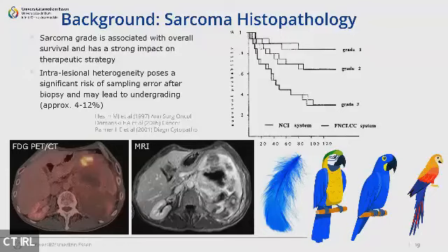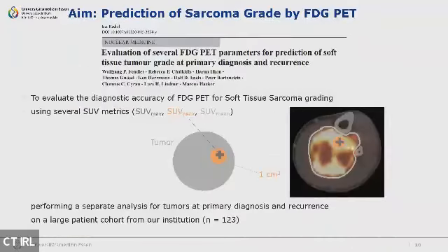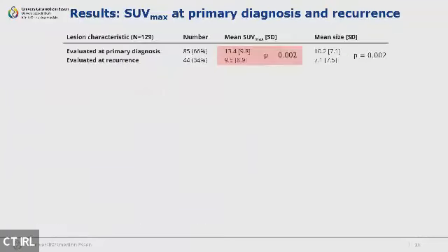You need to understand most of the bird to see which species and which branch you have in front of you. And PET-CT can help to characterize and predict the sarcoma grade by looking at the tumor metabolism. This is what we analyzed in one of these studies. By making a metabolic image of the tumor, we analyzed the uptake, the metabolism inside the whole tumor, but also the highest uptake, the highest metabolism that we can measure. We did this in 123 patients and tried to understand, if the tumor is resected afterwards, is there a correlation between our imaging? Can we predict the aggressiveness of the tumor using these images and the measurement of metabolism in those patients?